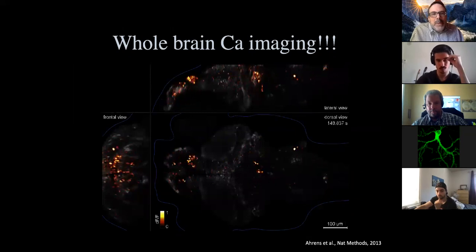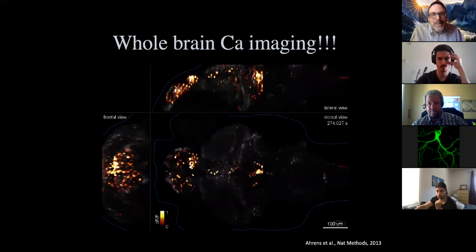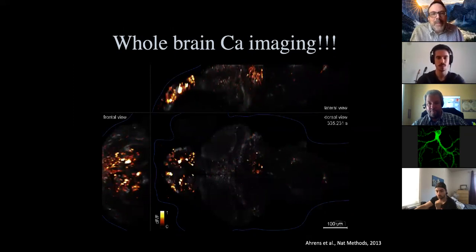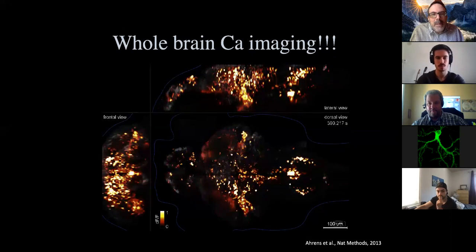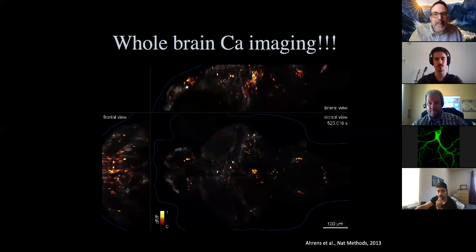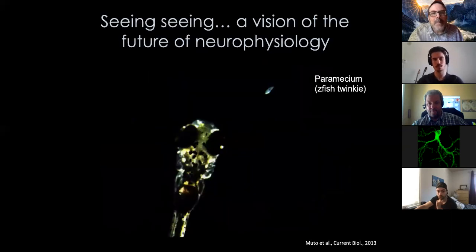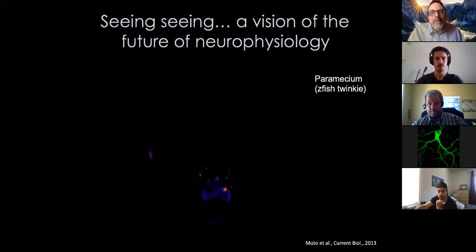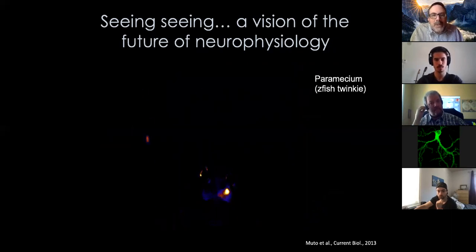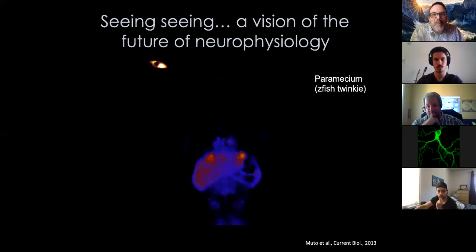In our lab, we're not doing light sheet, in part because we're interested in the visual system, and we feel the light sheet would introduce some artifact. But we do rapid focus, high-speed two-photon imaging through the optic tectum in order to collect this kind of information. It's not as fast, but it's still pretty good. And so the goal, I think, for people like me, is to be able to watch the animal actually watching the stimulus, right? This kind of thing, which just 5 years ago was kind of a fantasy, was to me my dream experiment.